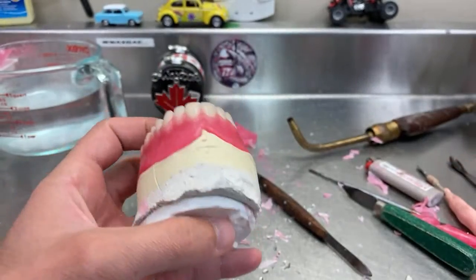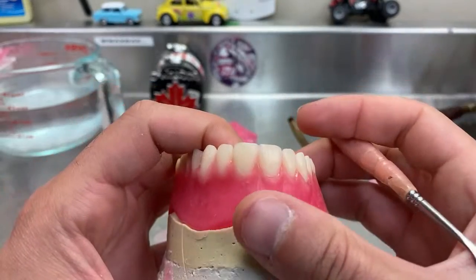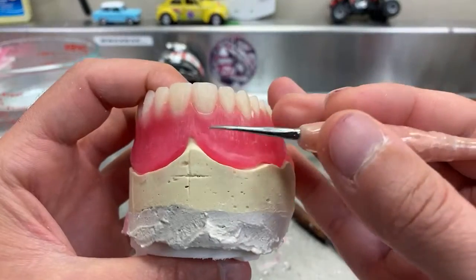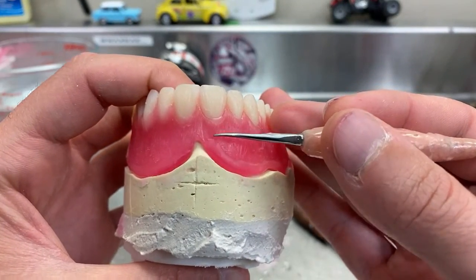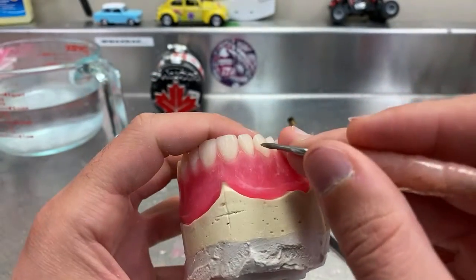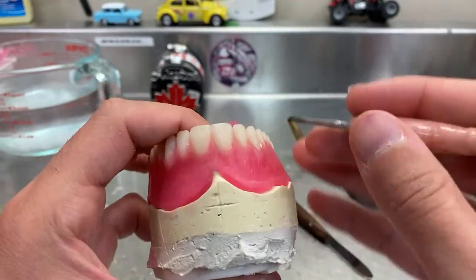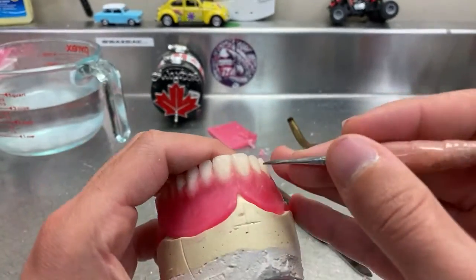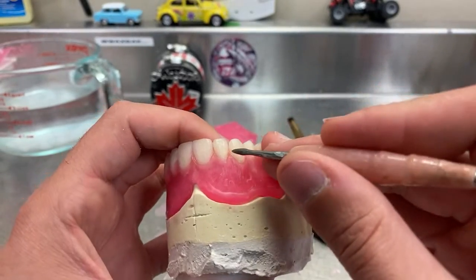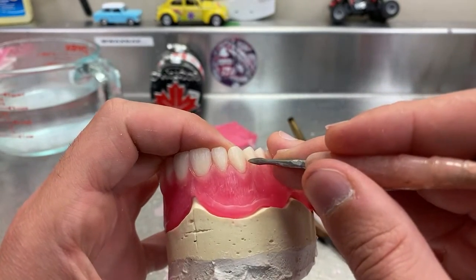So yeah, you carve this. The lateral will be a lower carve, and then you have the canine, the highest in carving, because usually canines are exposed more depending on the patient, and of course that's how I do it for aesthetics. If you look at your canine in the mirror, you'll find it covered to here or here, depending on the person.